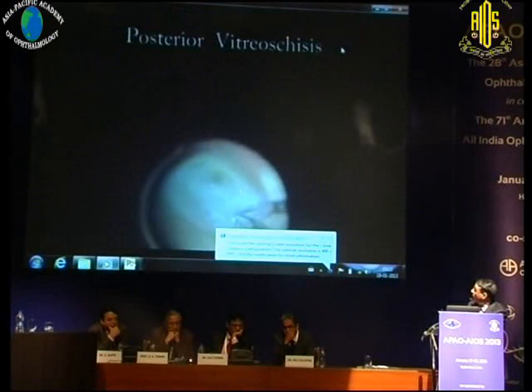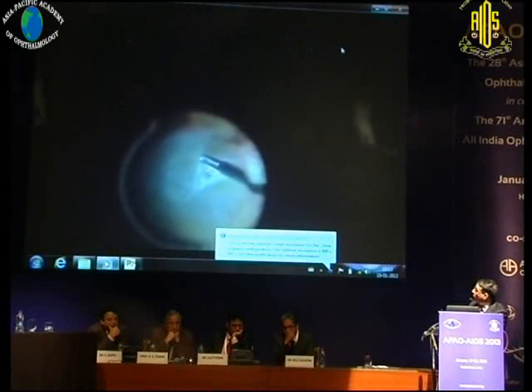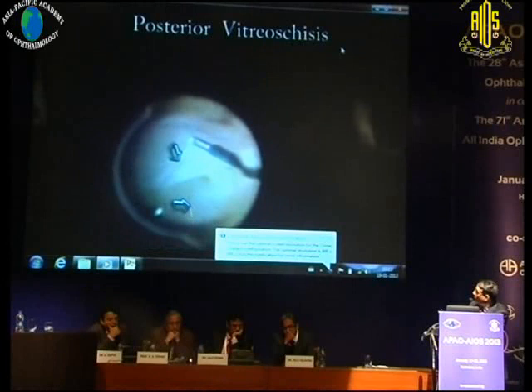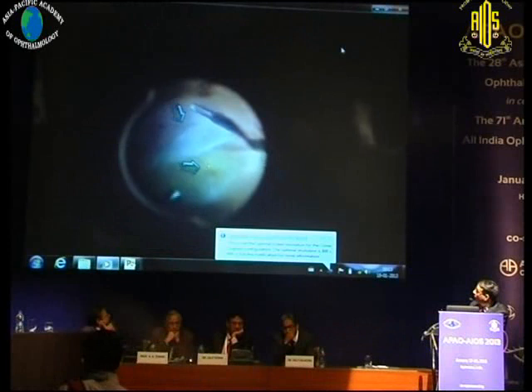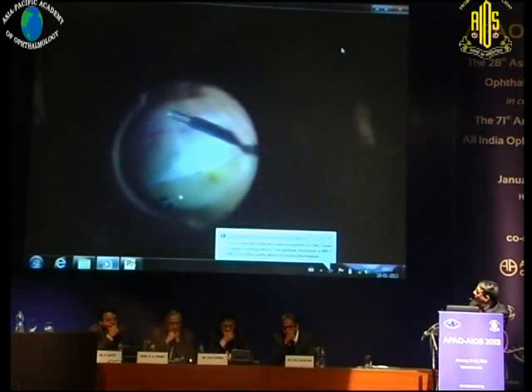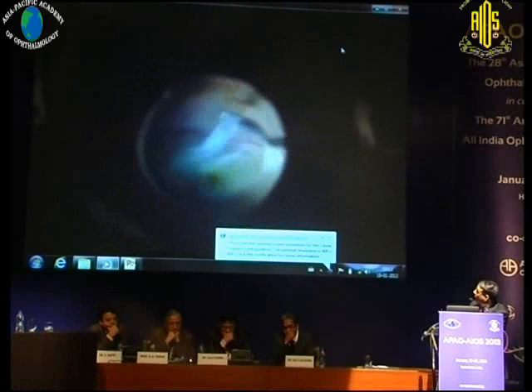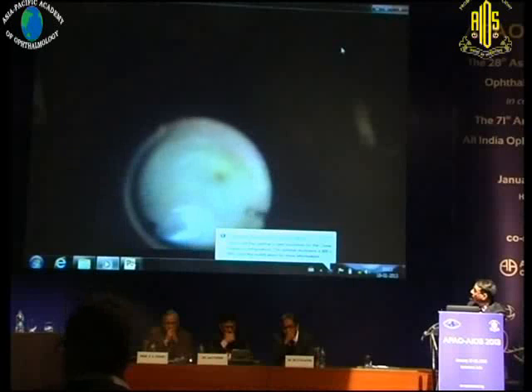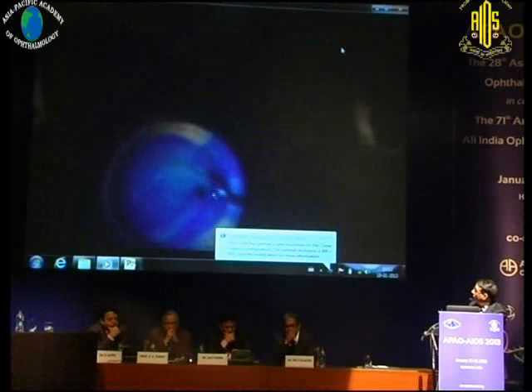This video illustrates the concept of vitreous schisis. You appear to have gone through the posterior hyaloid, but when you pick up that edge and start removing it — this is actually a VMT case, just to illustrate the principle — you see another membrane getting lifted up when pulling on that apparent posterior edge of the hyaloid. That second layer is the true posterior hyaloid. One could argue the first layer was the internal limiting membrane, but as you see subsequently, once that is removed and brilliant blue is applied, a third layer — the actual internal limiting membrane — is revealed.